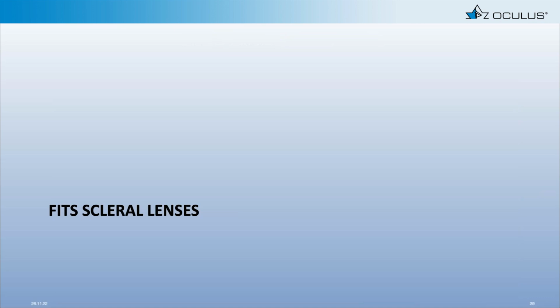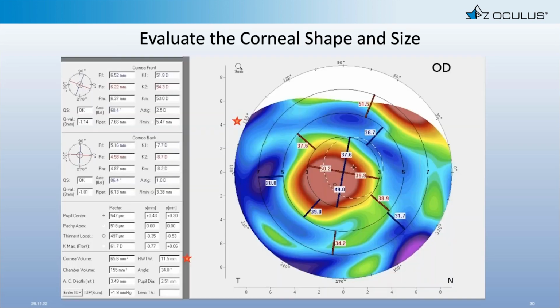So we'll spend the last little bit of our time tonight going through how we can use the Pentacam also to fit scleral lenses. And before we get deeper into the scleral topography, don't forget, even though I'm using scleral topography a lot to help me with my lens designs, and even in many cases using integrated software to design those lenses, I always stop and look at my initial corneal topographical or tomographical information first.